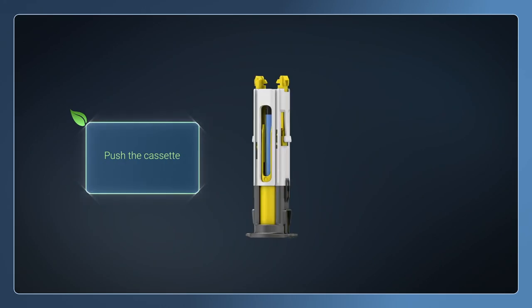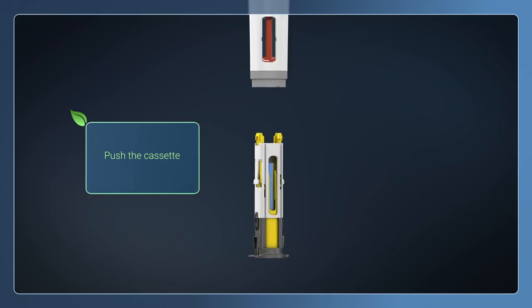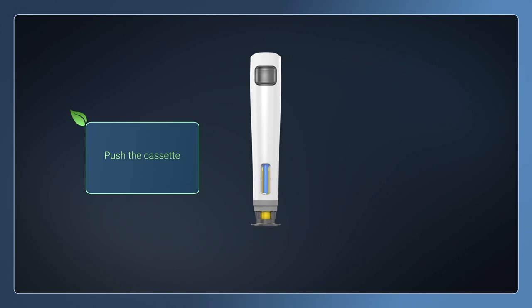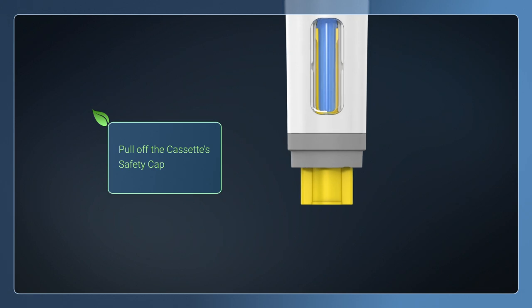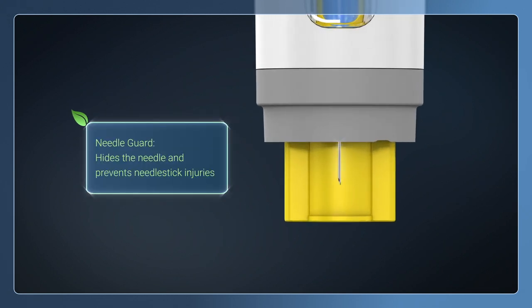Push the cassette into the reusable device. An audible click indicates that the cassette is fully inserted. Pull off the cassette safety cap. The needle guard hides the needle throughout the entire injection process and prevents needle stick injuries.